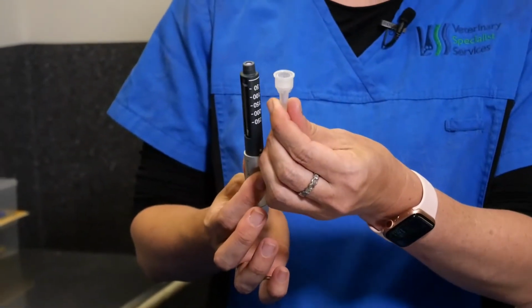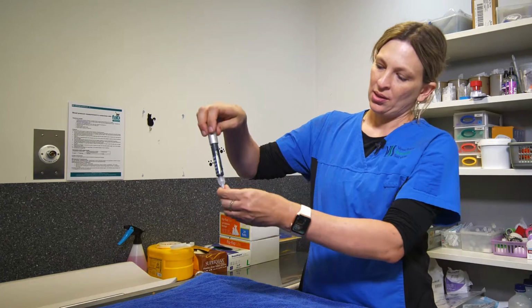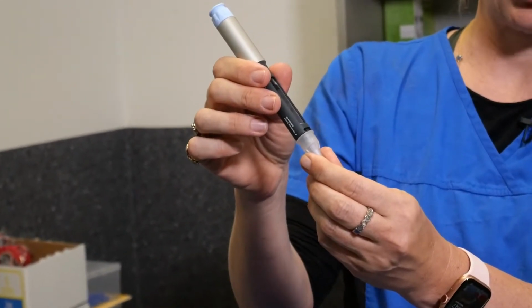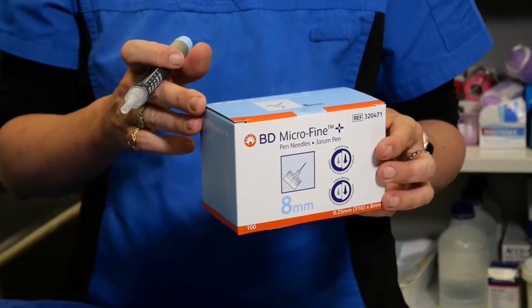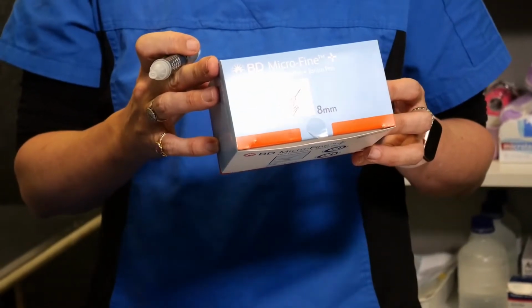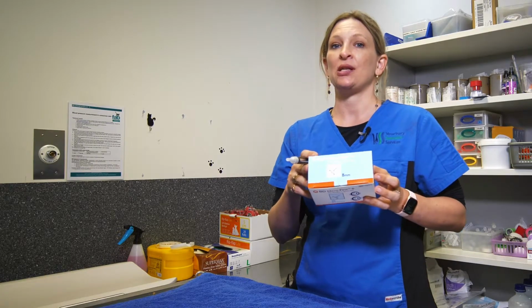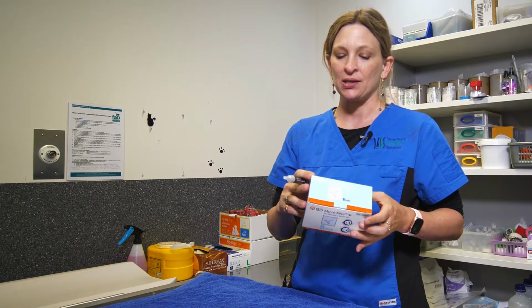Next, you need to use special needles for these pens. Basically, you push the pen in here and screw it down onto the needle to make sure that it's attached to the pen. The needles that we're using here are the BD Microfine needles, and the important thing is to make sure that you get a needle length that is long enough. These are 8mm needles, to make sure that we get right underneath the skin of the cat. If we use shorter needles, then you may not deliver the insulin in an appropriate fashion. So just make sure that you have 8mm needles for your cat.